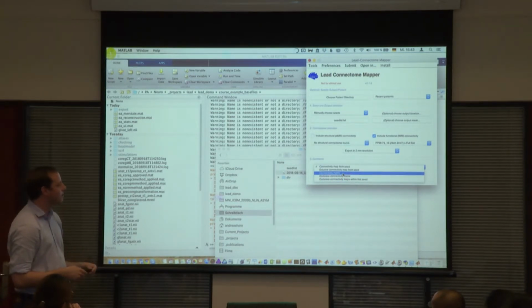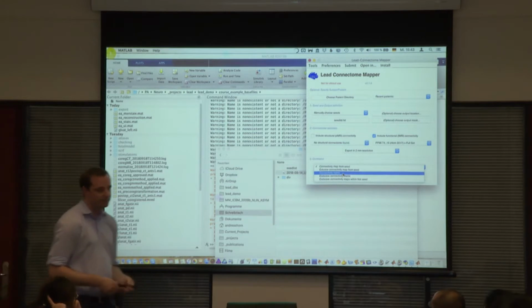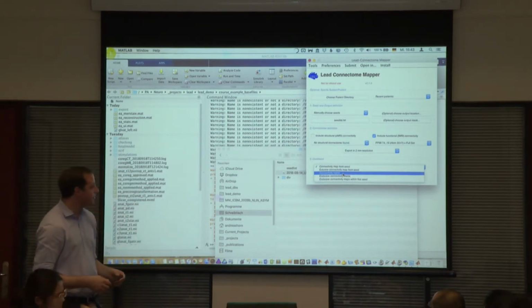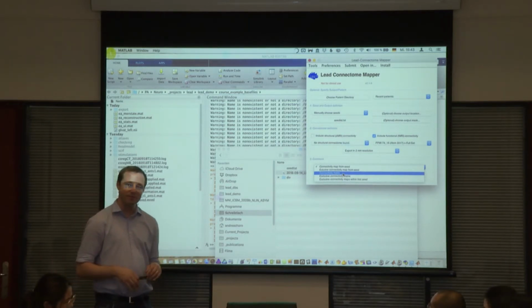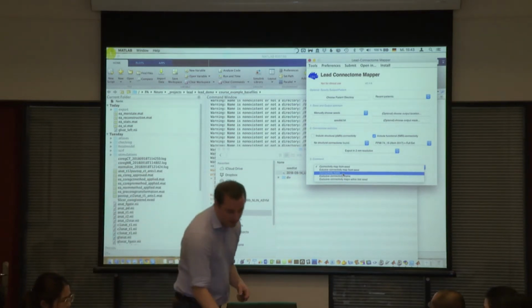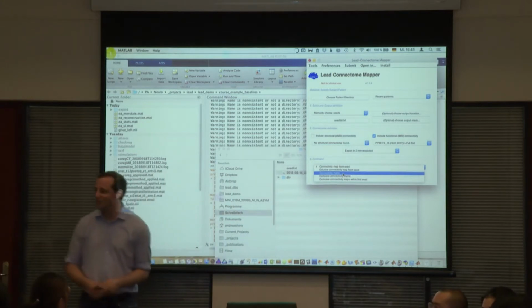That would be basically the inverse of the connectivity matrix. So the partial correlation in fMRI and in diffusion MRI is a bit more correct. Right, but I think these 2, yes?